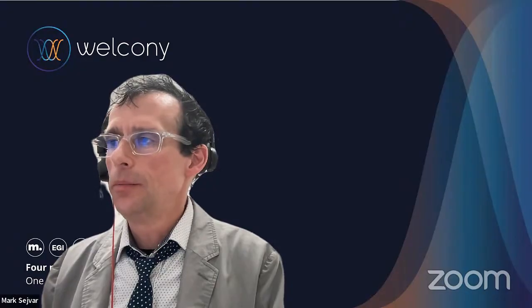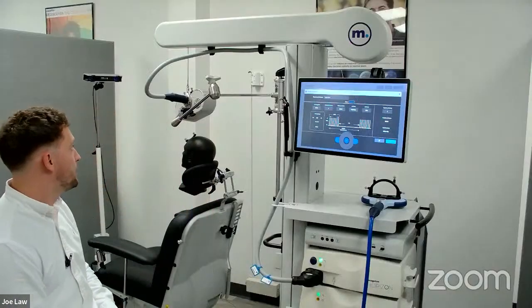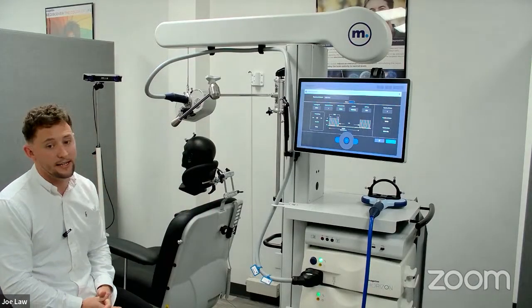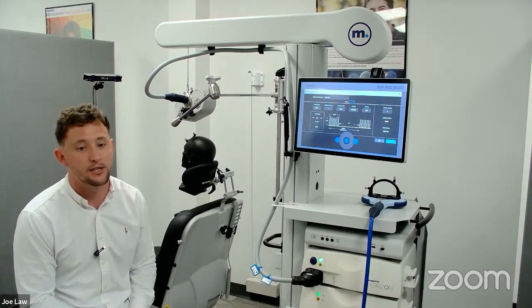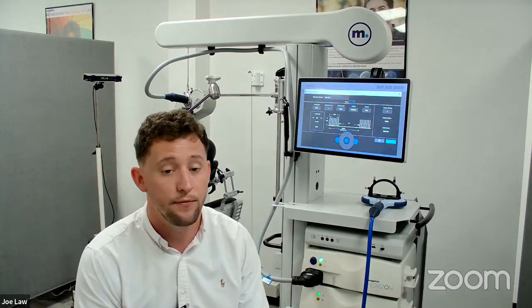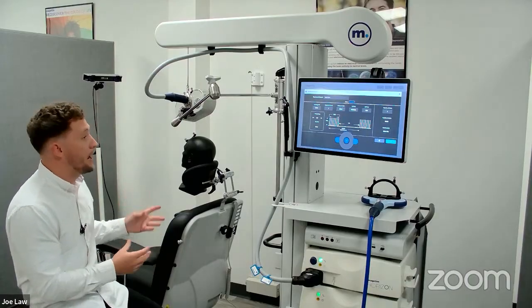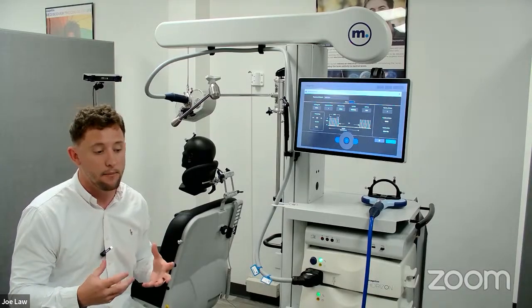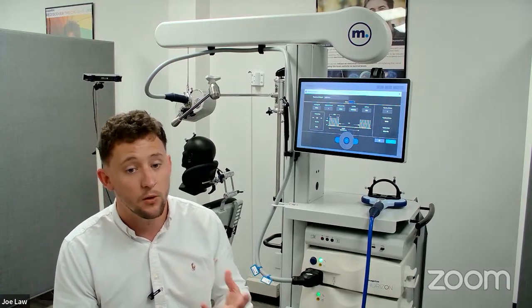Great. Another question: how loud is the air-cooled coil, particularly for OCD treatments? That's a great question, and it's kind of down to the clinic itself. As long as you stay within our operating means, which is around or below 72 Fahrenheit ambient temperature, the fans usually stay pretty low. If you have a warm clinic environment, those fans are going to need to work more to bring more air in to cool the coil down.